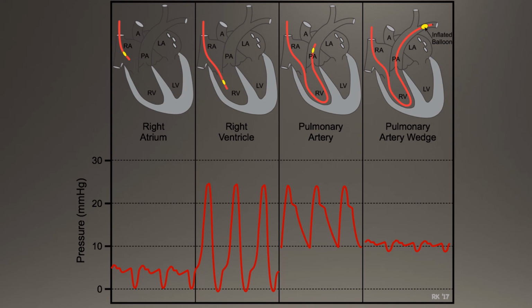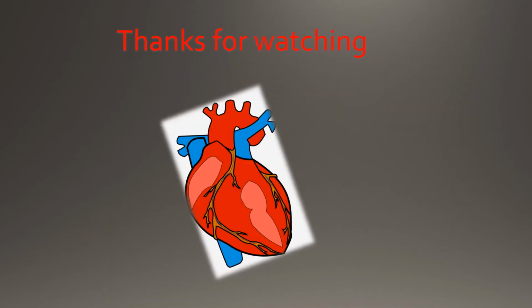So now you're probably thinking, well, she just told me I had to have a wedge pressure to diagnose cardiogenic shock and shock from an RVMI. Here's the really cool thing. Look at this chart one more time, but notice how the diastolic value of the pulmonary artery is really close to the same reading for your wedge pressure. Use this value and you have no need to wedge.